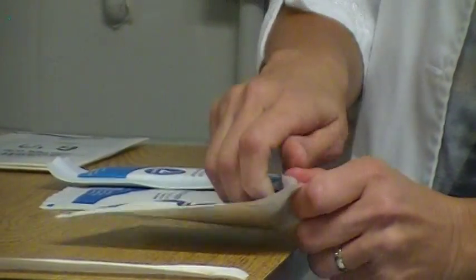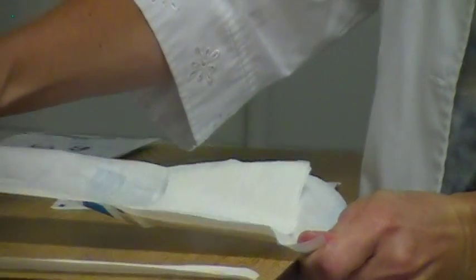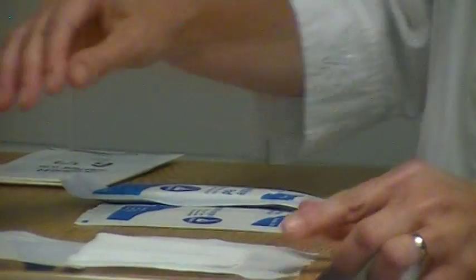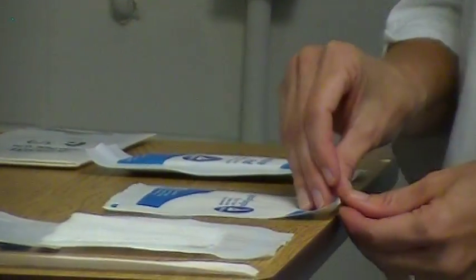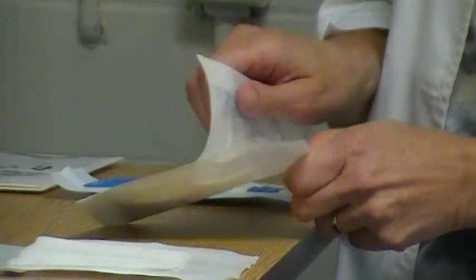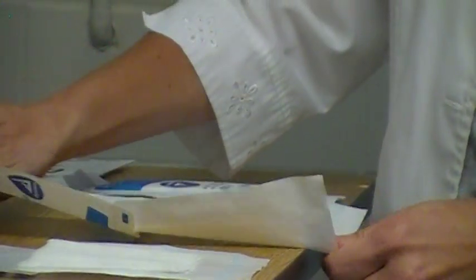Next, I'm opening my package of 4x4s. Remember, one package will be wet, and one package is going to be dry. The dry one just to help absorb any moisture that may be present.